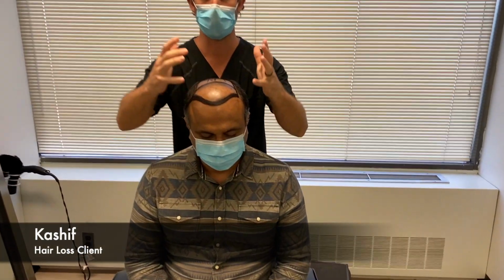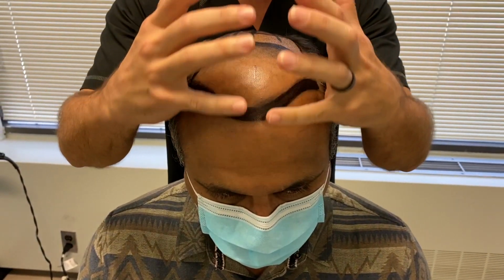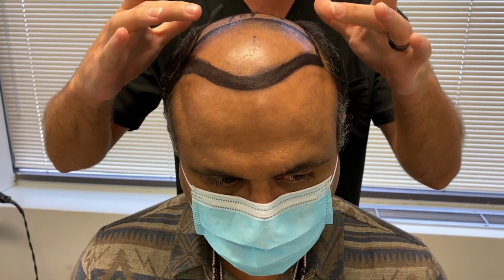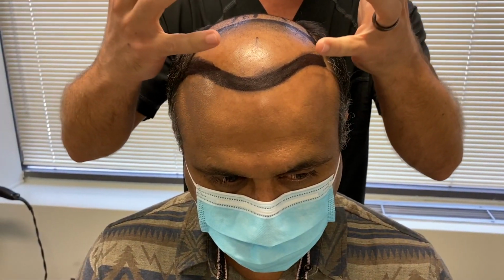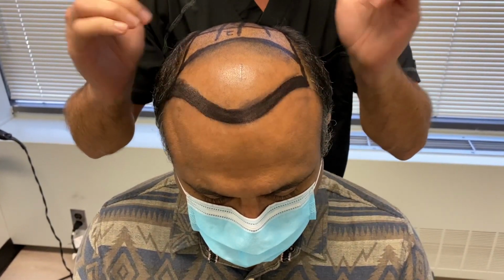Okay, everybody, we are back with Kashif, and as you can see, we've drawn the lines out here, and I'm just going to show the lines of what we're going to do. Again, a nice, reasonable line, something that's age appropriate, that's going to look good. We're not trying to overdo it and bring it down too far to make him look 18 again. That's not what we're trying to accomplish today. Also, the lower you go, the more hair you're going to use down here, the less hair you will have up top. So we thought this was a reasonable spot.